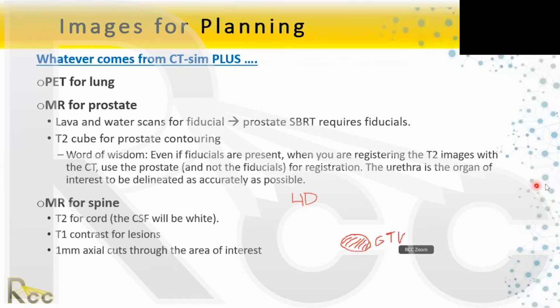Next, I want to know what the motion is. I want to know how high it goes, and I also want to know how low it goes, because remember, this is just an average scan. And in order to know how high it goes, what Shada is saying is that we have the phases of breathing, 0%, 50%, back down to 0%. She's saying that she will go to the 50% scan. So now this image is going to look different, and we're going to see that the tumor has risen during the maximum point of exhale.